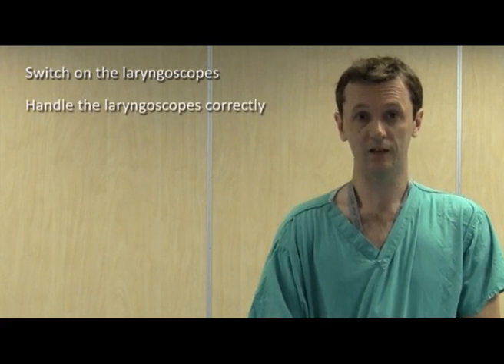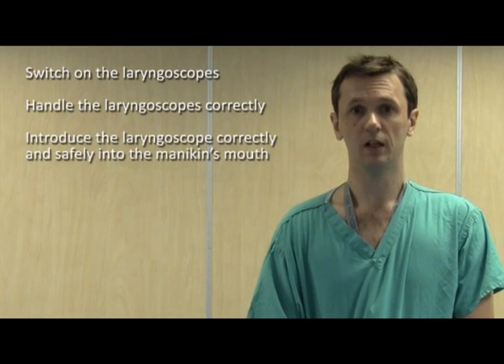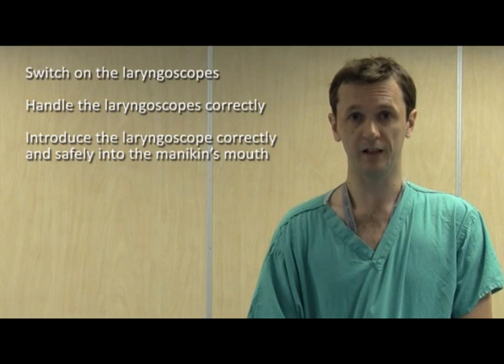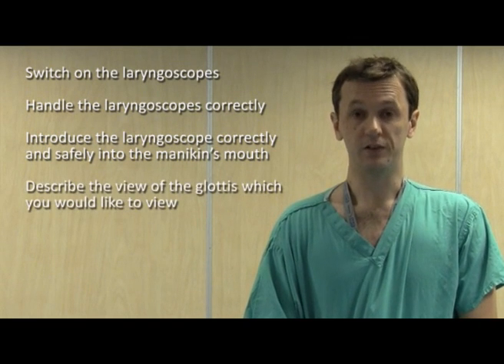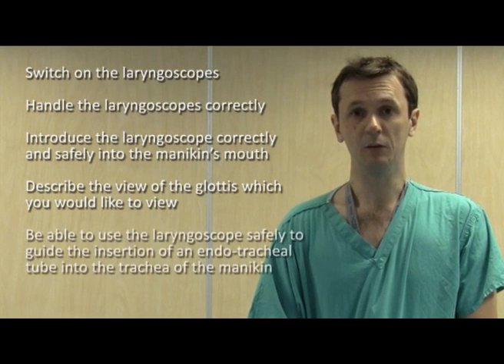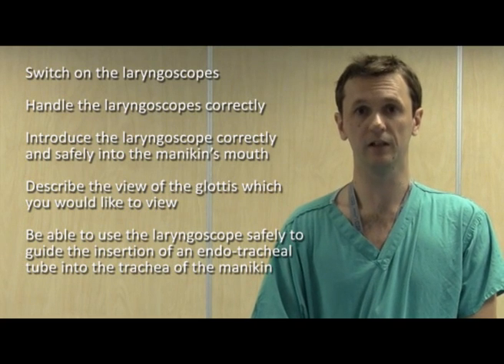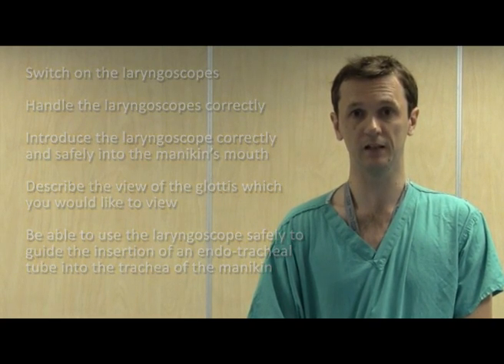By the end of watching the video, you'll be able to switch the laryngoscope on, handle the laryngoscope correctly, introduce the blade of the laryngoscope safely and correctly into the mouth of the mannequin, describe the anatomy of the glottis which is your target, and use the laryngoscope to guide the insertion of an endotracheal tube into the trachea of the mannequin.